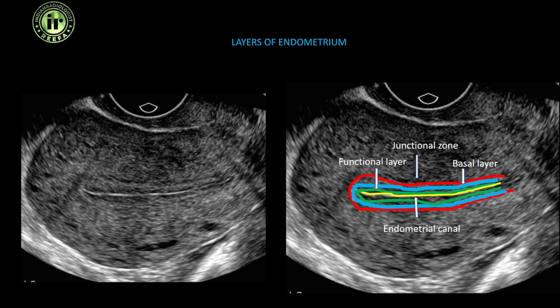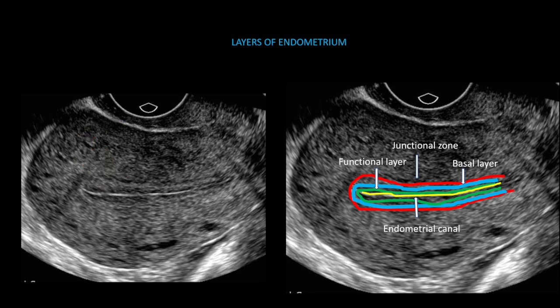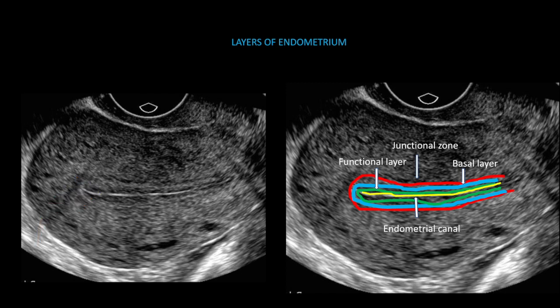On the left side of the screen, we can see a transvaginal scan of the uterus showing a trilaminar appearance of the endometrium. The outer echogenic area is the basal layer, the hypoechoic area within it is the functional layer, and the central echogenic line is the endometrial canal. The thin hypoechoic area beyond the basal layer is the inner myometrium or junctional zone, which we specifically note when looking for adenomyosis.